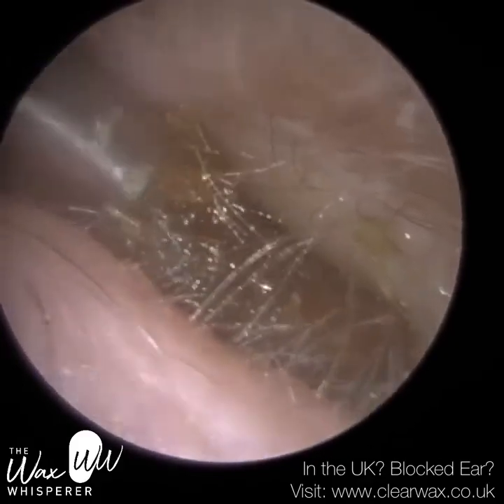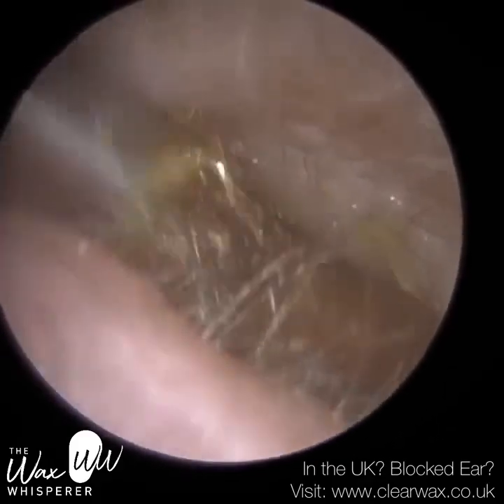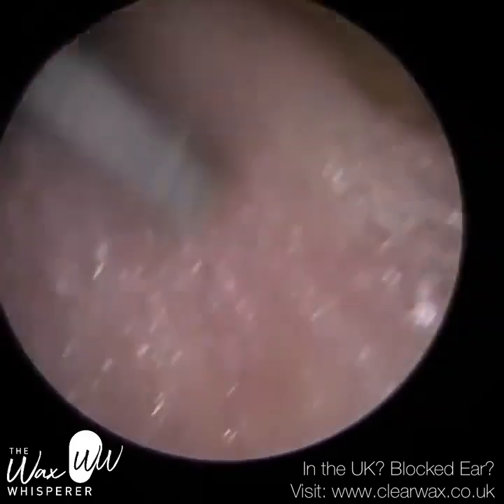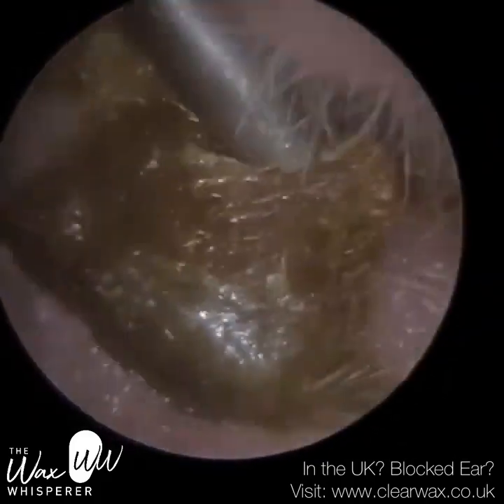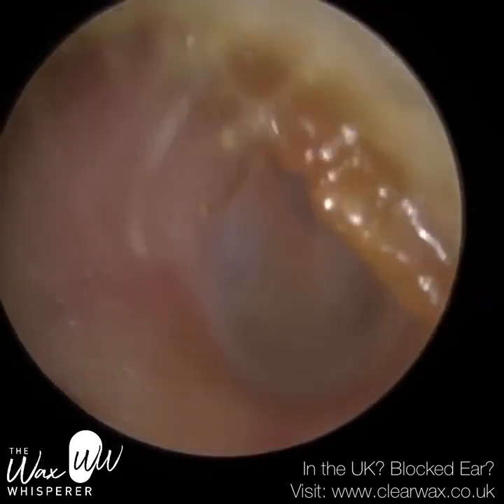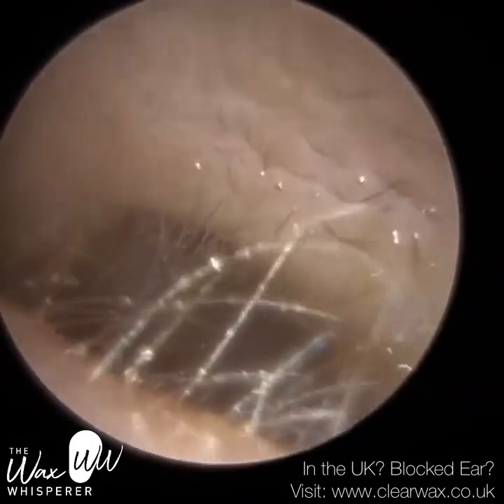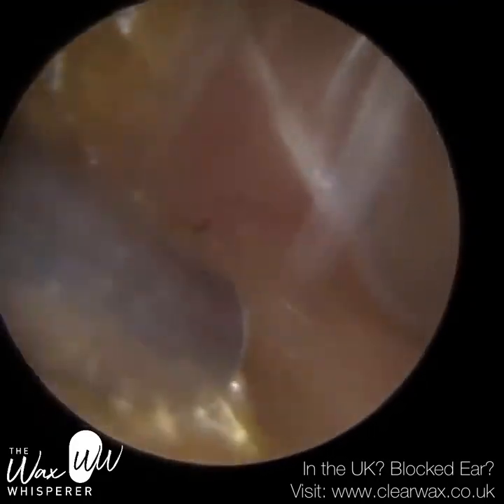And there's two schools of thought here. The first school of thought is earwax was normally, when you perform suction, done using a microscope. So the specialist would visualize the inside of your ear using a microscope, hence the term microsuction. Another school of thought is the suction probe that we use to vacuum the earwax out of your ear is very, very small, it's very thin. So the term micro can be used to describe the size of the suction probe.